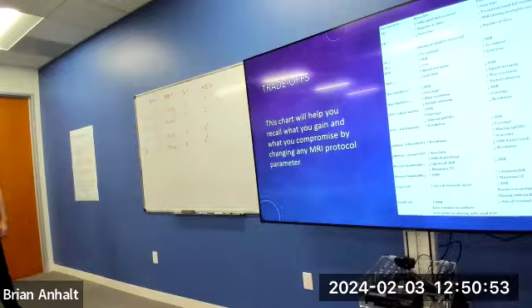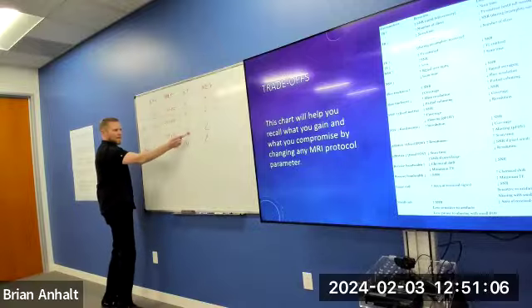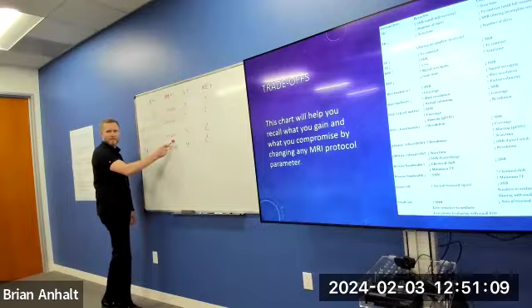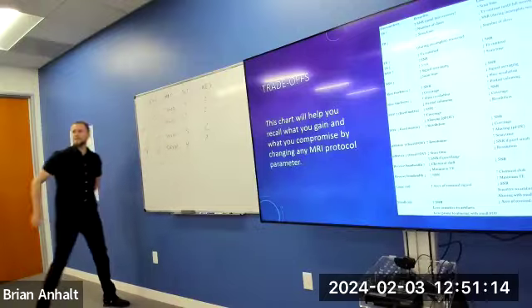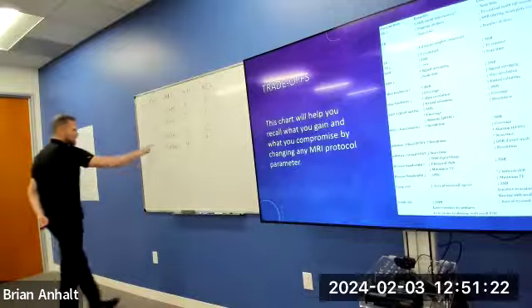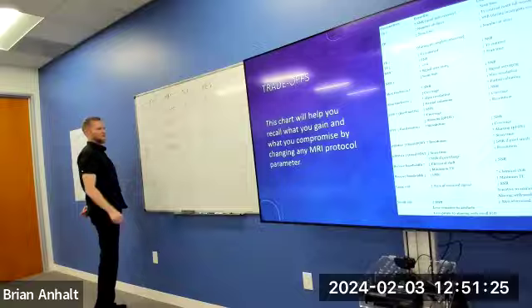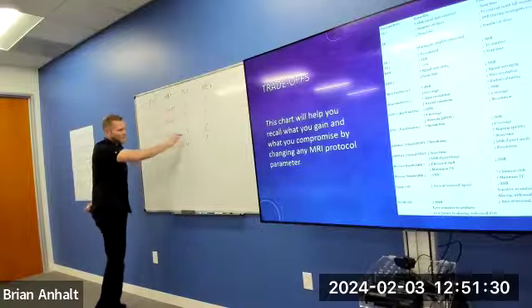Which one of those has the best resolution? Out of all of them up there. 3. Look at this. Smallest field of view. Thin slice. Fine matrix. If we did the math on this, this voxel volume would be much smaller than any other on here. You could literally do the math if you wanted to, but you don't have to. This has a much smaller field of view than 18 or 30, right? We already know we're on the right track. No, it has a super fine matrix, right? And a really thin slice.